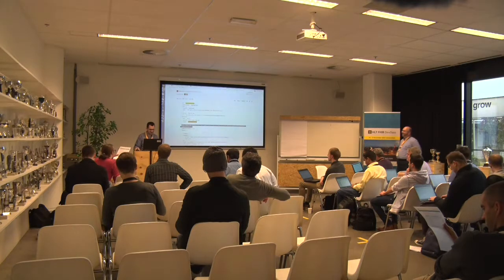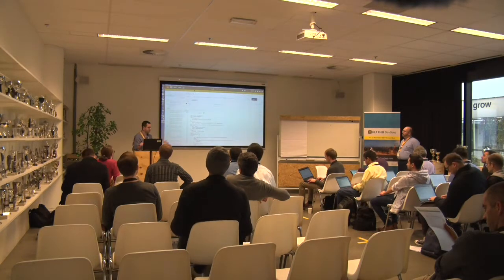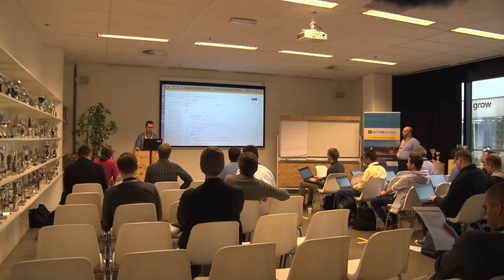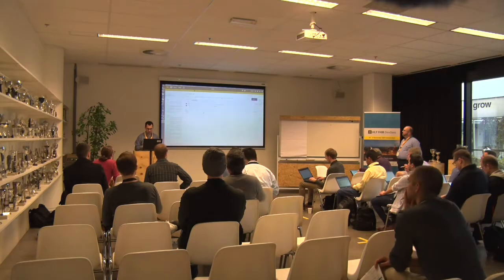Let's go back and try this out. Again, you can copy the UID from the previous response. I will just take the shortcut and do the whole thing. Of course, I should also mention, our FHIR server defaults to returning JSON. But the trick is, if you want to switch to XML, you can just switch to, let's say, text XML. And there, everything comes back in XML. So it comes down to your preference, really. I'll probably keep it with XML just because it looks a bit nicer, a bit more readable.